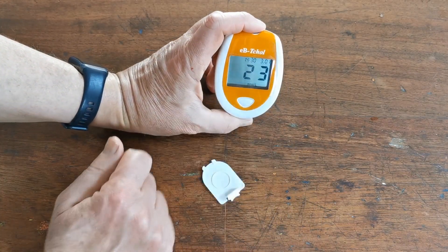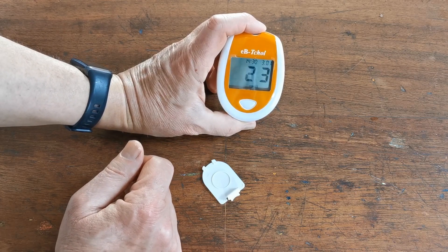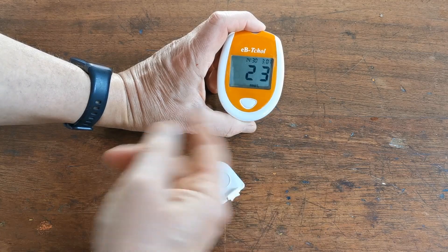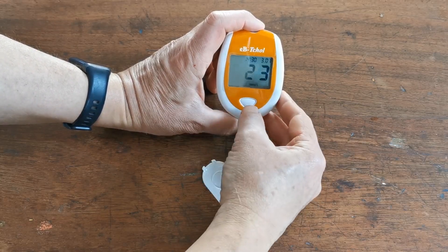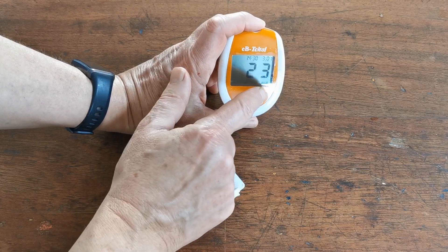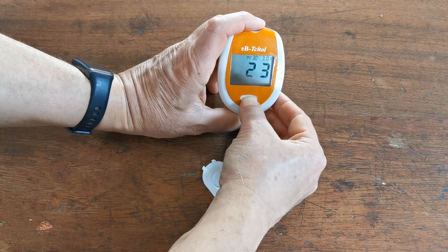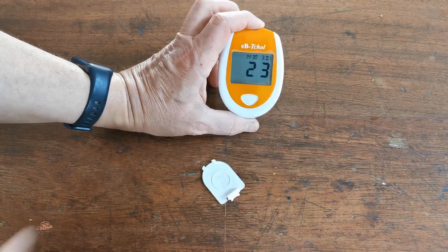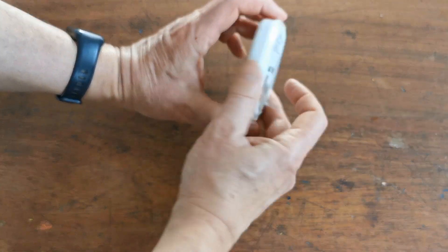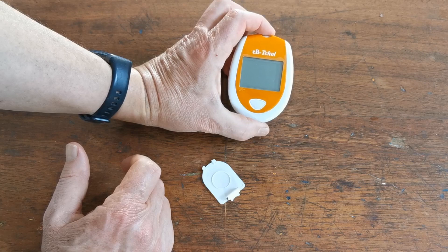What's displaying and flashing along the bottom is the unit of display. You can select between millimoles per litre, which is the standard UK setting, or milligrams per decilitre. To change it while it's flashing, just press and hold the control button on the front — it will jump to milligrams per decilitre. Hold it again and it will go back to millimoles per litre, which I'm selecting for UK users. Then press the settings button and it will switch off.